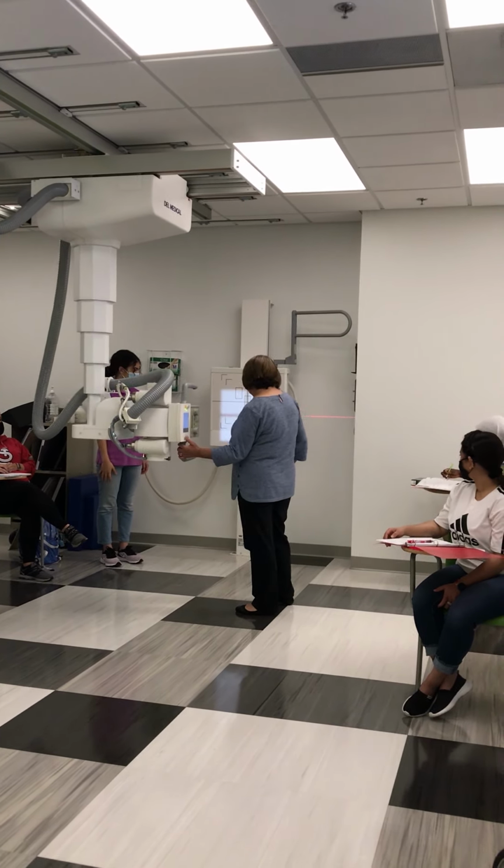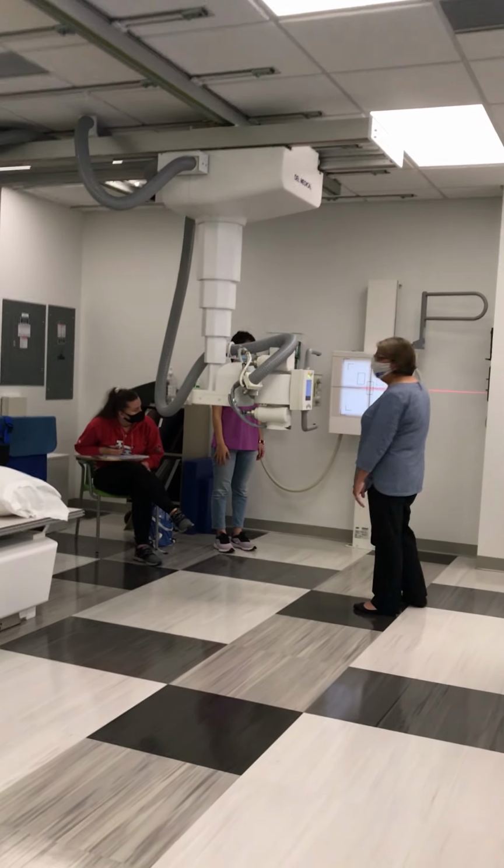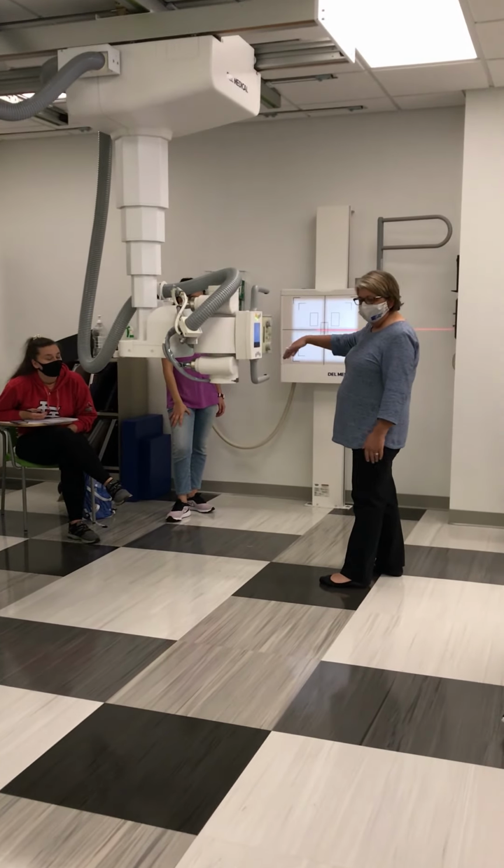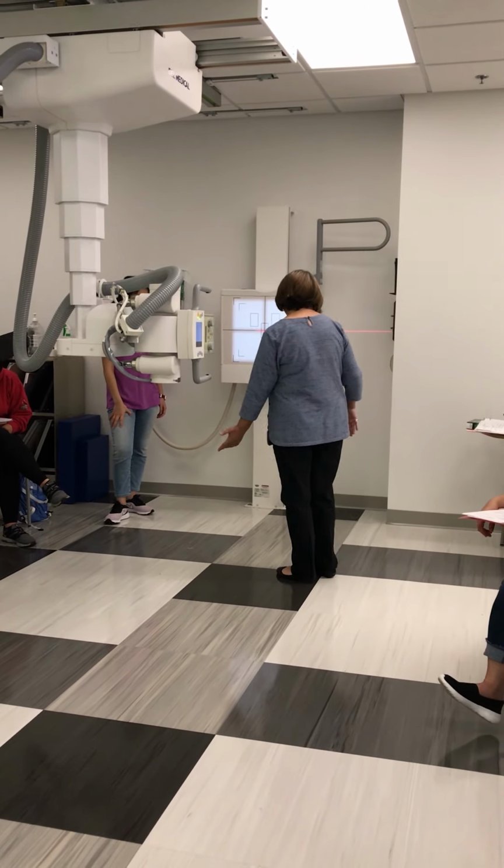And my patient in place here, now I'm going to center. When I have my tube in detent, the default is for the collimation size to expand to 17 by 17 inches.